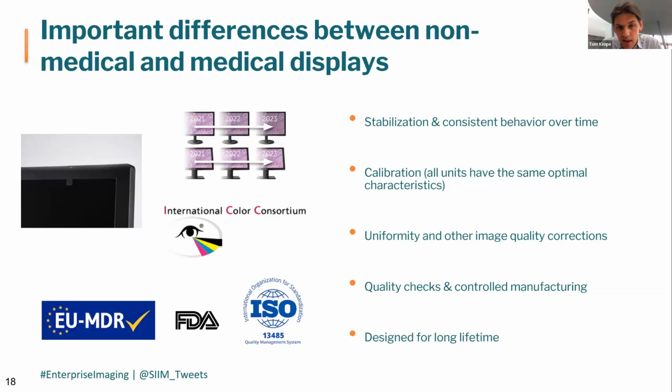The second one is calibration. So I explained a few minutes ago about the importance of correctly visualizing images based on understanding of the human visual system. Well, that's exactly what calibration will do. Calibration will make sure that the images are visualized in such a way that they can be optimally perceived by a human observer and that all the details can be optimally seen.